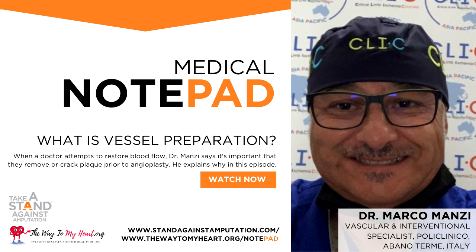So that's why a proper use of this device, a proper use of vessel preparation, means less pressure, and we permit the drug to arrive into the internal part of the vessel, and we can prolong the patency of that vessel. Of course, every vessel preparation procedure needs more time than a normal angioplasty. We have to invest time, we have to spend time in order to have better results in the future.